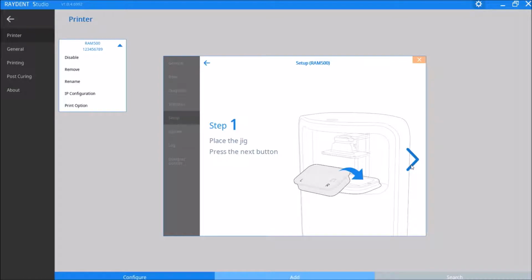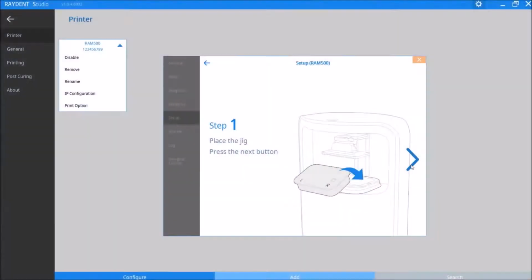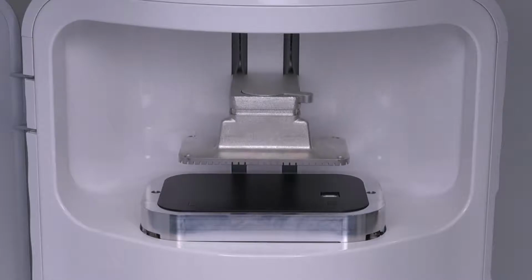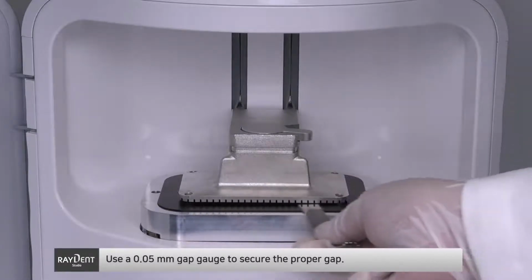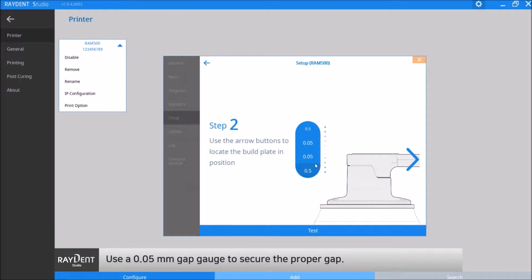Step 1. Place the jig into the chamber and make sure it's firmly and well placed. Once you're done, click Next. Then the build plate will come down to the current default position. In Step 2, you can manage the height of the build plate from the software.